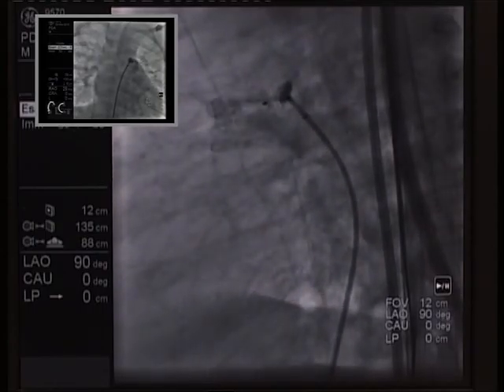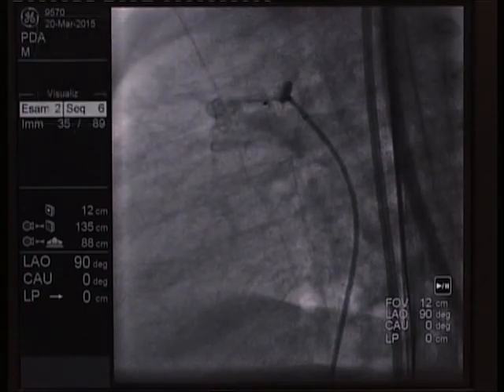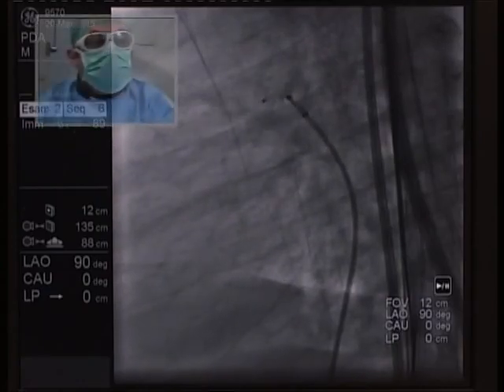So you don't distinguish if you see a jet. Of course, what we look at typically is not just a jet, but is there flow around the device in the ampulla? Because it doesn't fill the ampulla, obviously there will be flow around it because it's much smaller. We have someone in the audience that's going to make a comment.